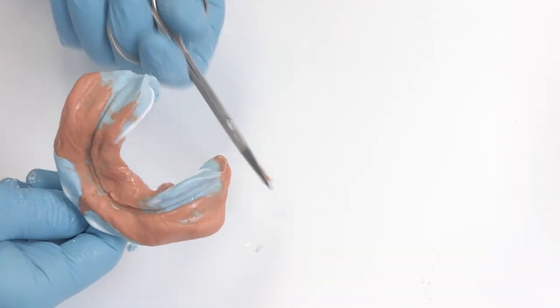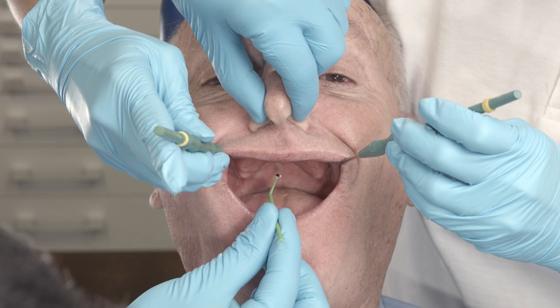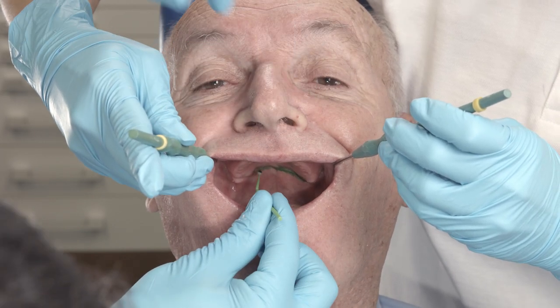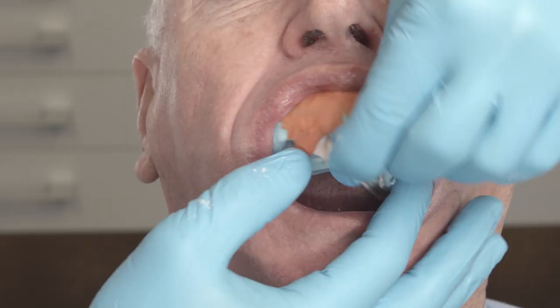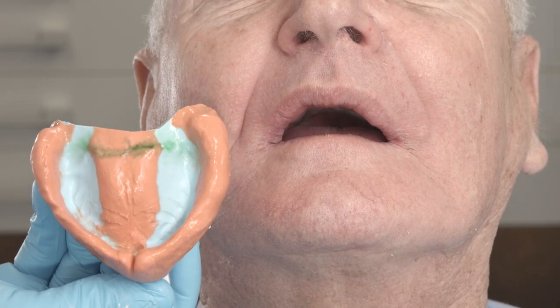Remove any excess material in the posterior part of the impressions. Use a special pen to mark the dorsal margin or palatal vibrating line in the upper jaw. This line can now be transferred to the impression. You can additionally carve in the line with a colored pencil or a scalpel.